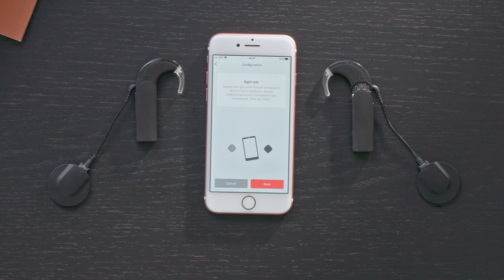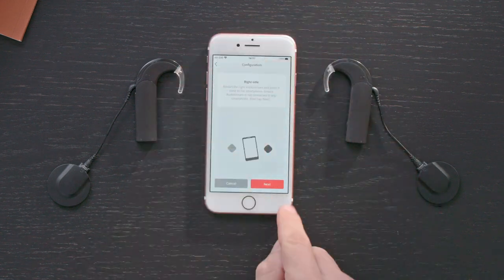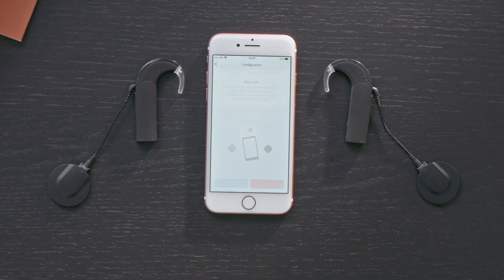If you want to use the AudioStream on both sides, repeat the previous steps with your second AudioProcessor. Leave the first AudioProcessor switched on during this.